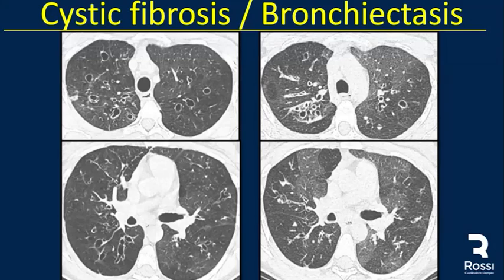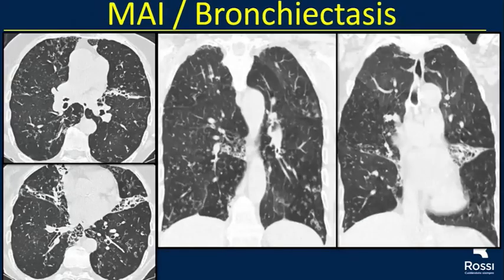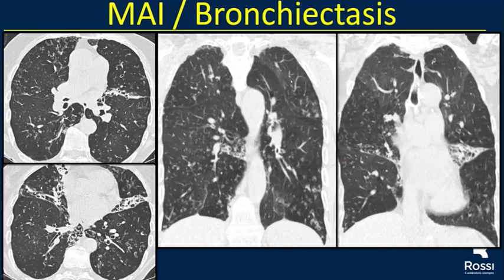Bronchiectasis and bronchiolectasis are another cause of air trapping — we can see cystic bronchiectasis in both lungs, and the expiratory CT shows those cystic bronchiectasis with areas of air trapping in large airway disease. Another case shows mosaic attenuation with patchy areas of high and low attenuation and small centrilobular nodules in a patient with MAI and bronchiectasis, involving the middle lung and lingula.